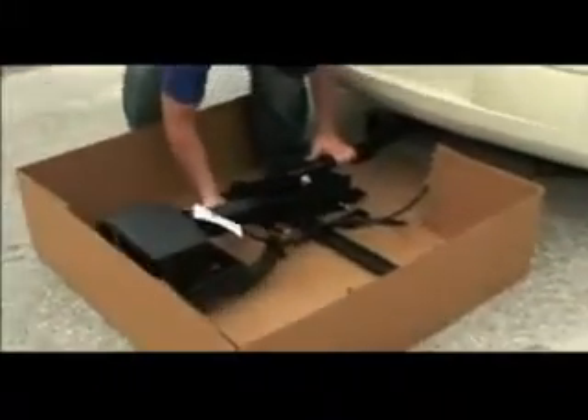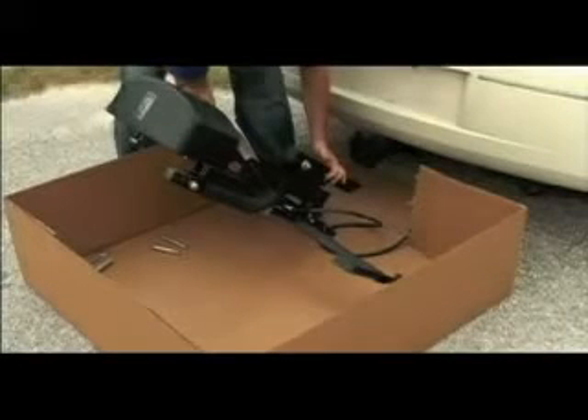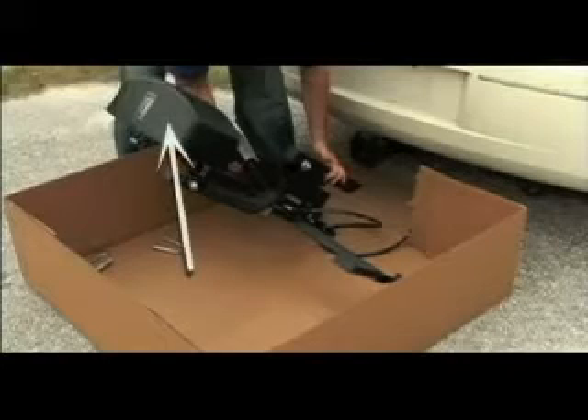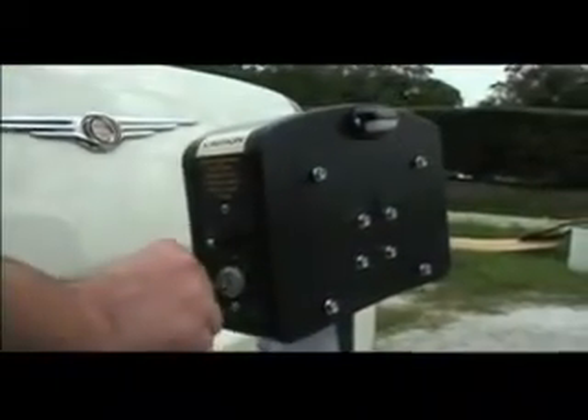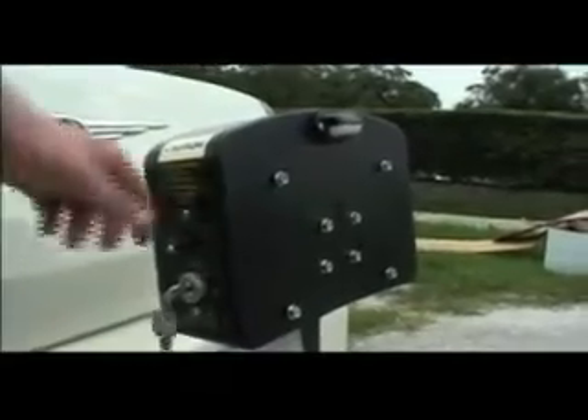Raise the lift to the upright position by grasping the outer tube and align with the hitch adapter. Make sure never to lift from the plastic motor box cover, as this may cause damage to your lift. Insert the key and turn it to the on position. Power the lift down — this will raise the hitch post into the hitch adapter. Continue until the bolt holes are aligned. Insert two bolts and tighten.